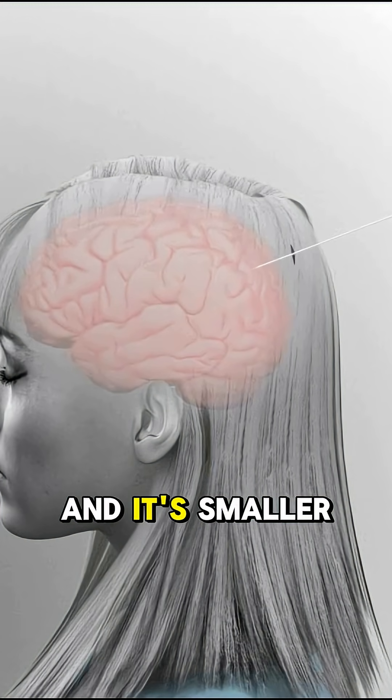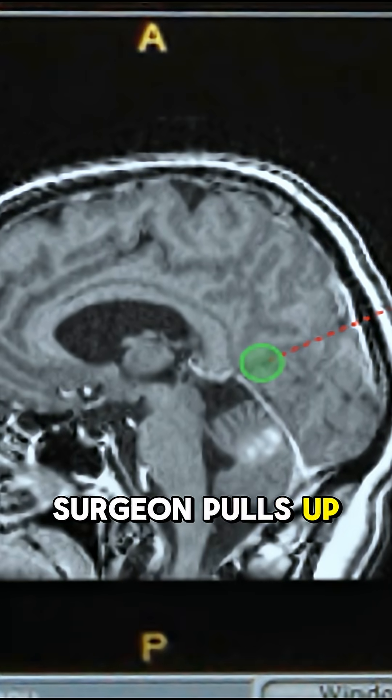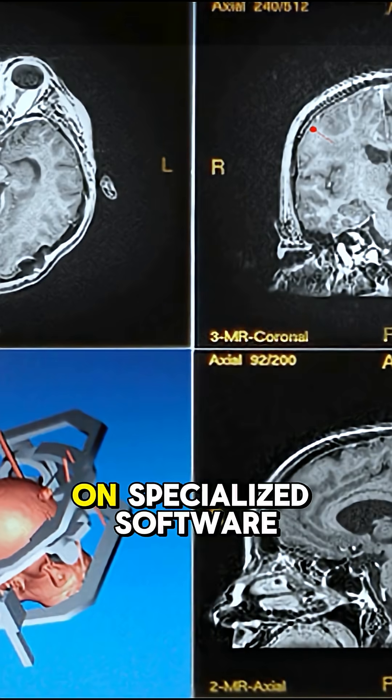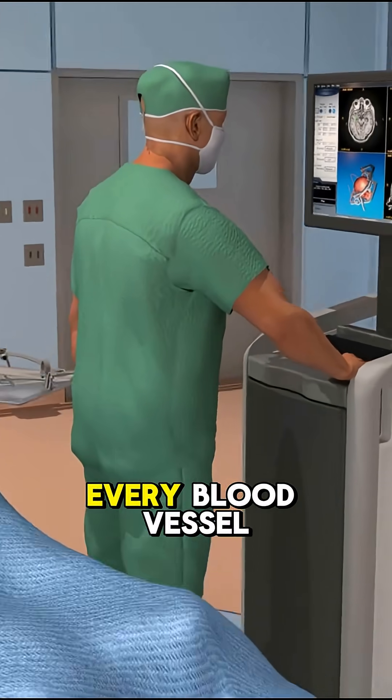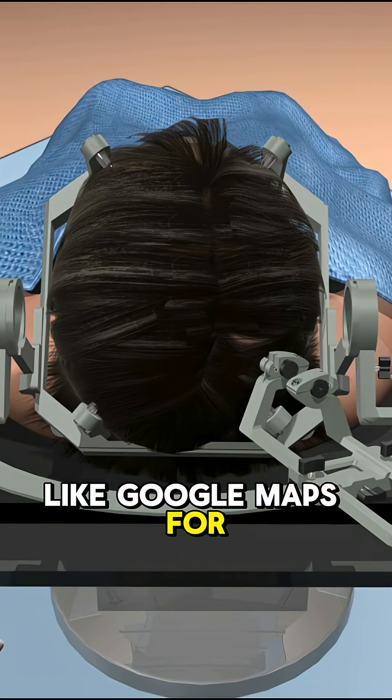A laser in your brain and it's smaller than a pencil tip. Step 1: the surgeon pulls up a 3D map of your brain on specialized software. Every blood vessel, every nerve — all planned out like Google Maps for your skull.